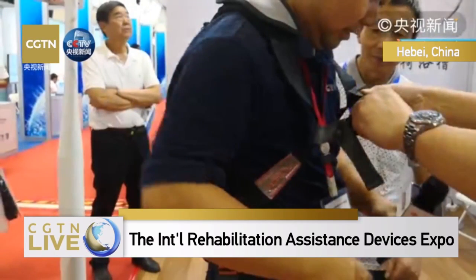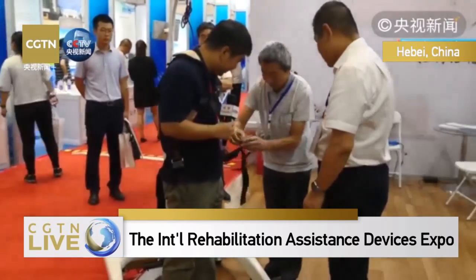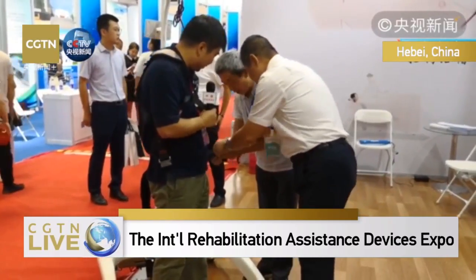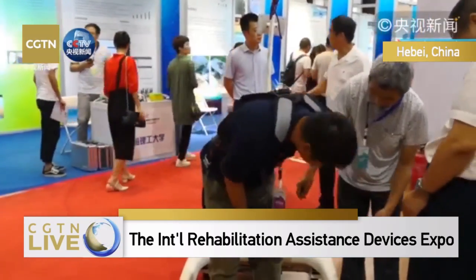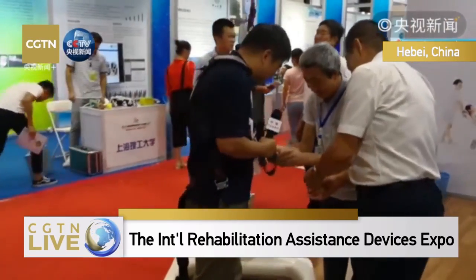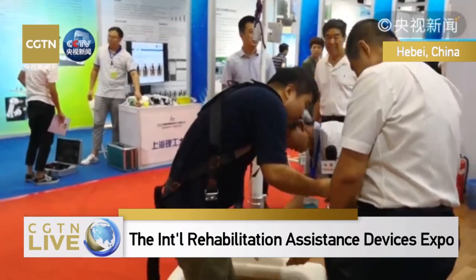This looks like a vest. Now let's see if it can bear my weight. We can connect the cable to it.